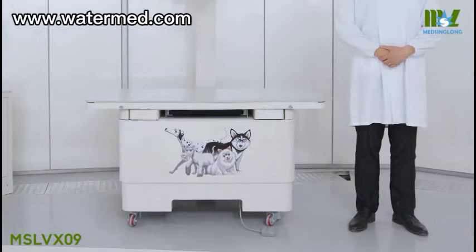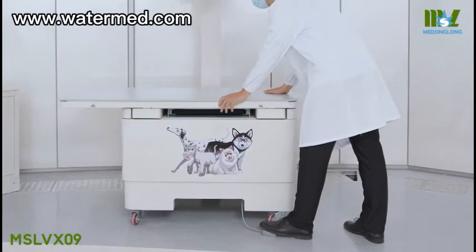The 4-way floating tabletop is quiet, so that it helps calm animals as they are positioned on the table.